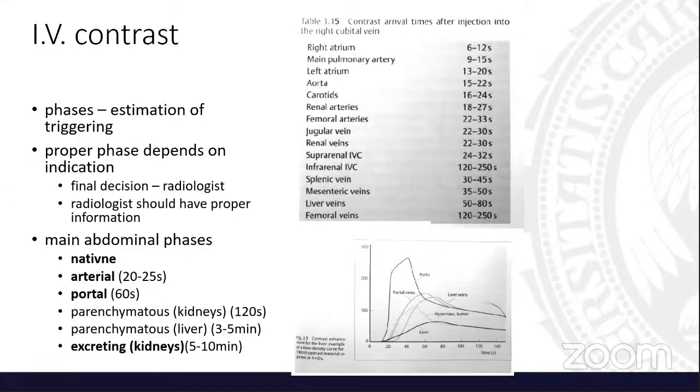Kidneys have usually special phases. That's, for example, two minutes. The thing is, you don't need to know that if you're not a radiologist. Actually, as a radiologist, I would totally discourage everyone else to know that, because it's not on the clinicians and on the students to know that. The only thing you should know is that there are phases, and radiologists should know how to do that.